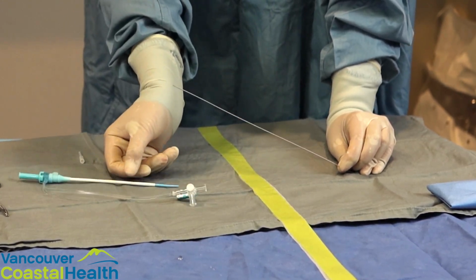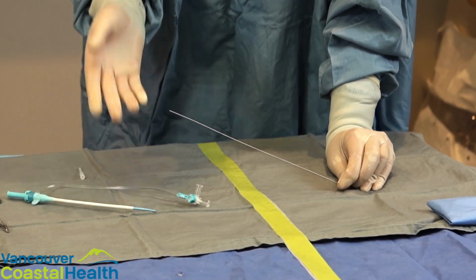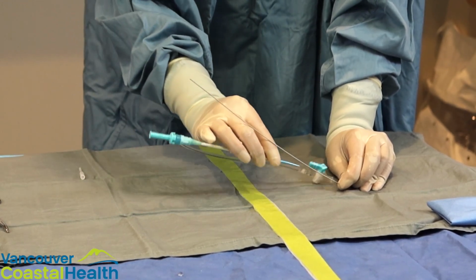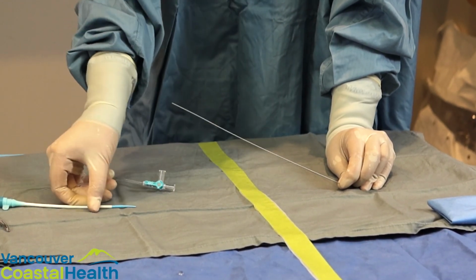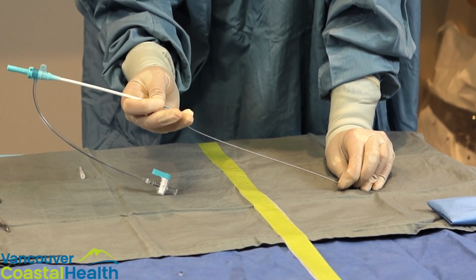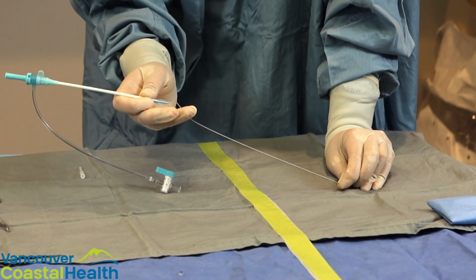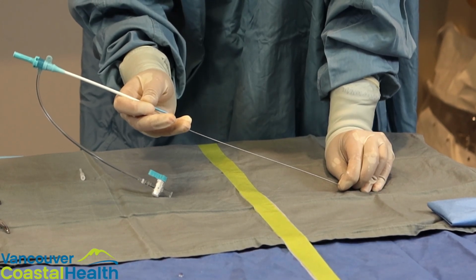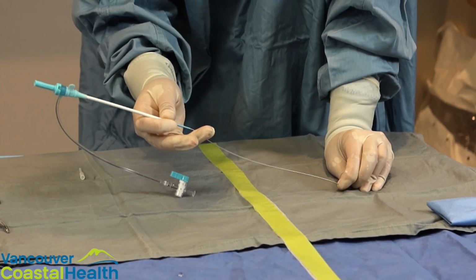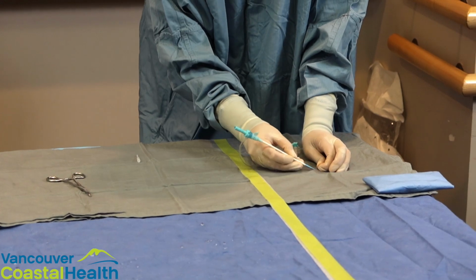This is a little bit awkward to do, so you can see if I'm working alone as a physician that I would be able to do it by myself, but if there is a scrub assistant to help, what you could do at this point is help thread the sheath onto the wire for the physician. So again, working by myself, I will just have to try and manage alone. The reason that they're doing this one-handed is because they never want to lose access into the hole, into the blood vessel, or into the tubular structure that they've made. So they need to try and thread the sheath onto the wire one-handed. So if you can assist at this portion, that's helpful. So they'll thread the sheath on and then push it into the patient.